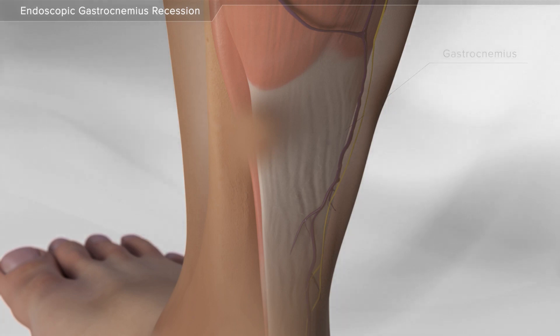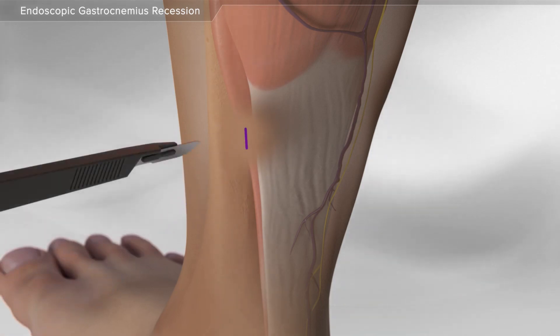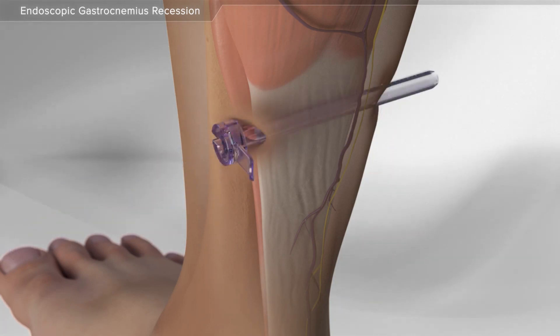With the ankle held in the neutral position, your surgeon makes a small incision on the inside part of the calf. Next, a cannula is inserted through the incision to allow access for the camera and other instruments.